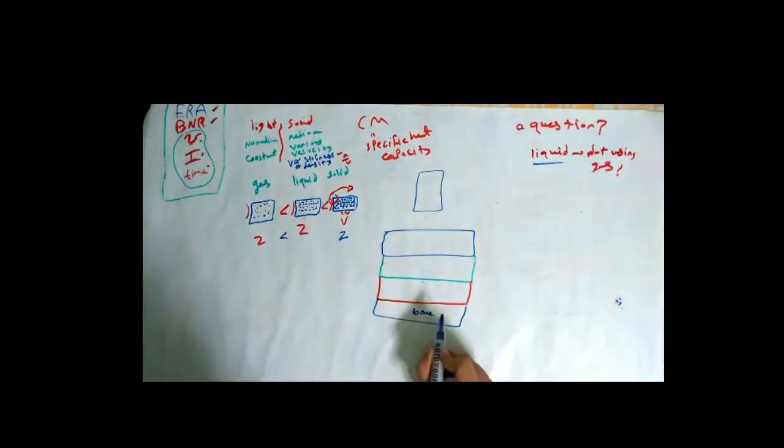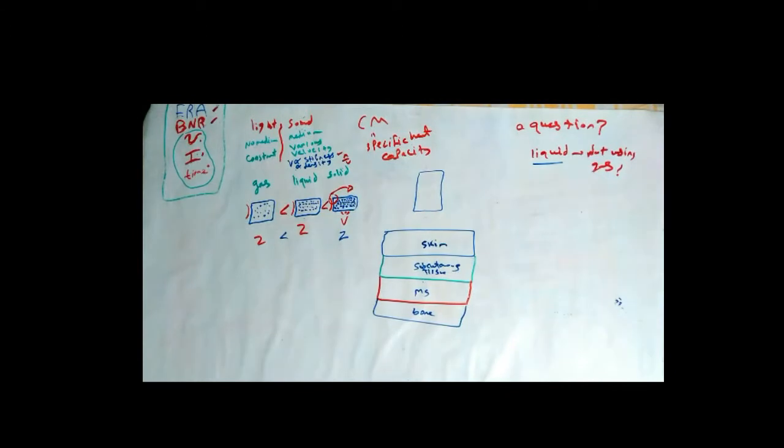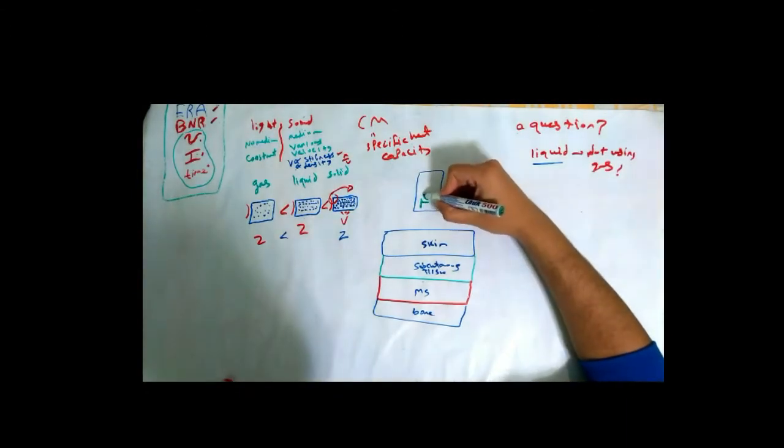So bone, muscle, subcutaneous tissue, and skin. So this is a transducer head.